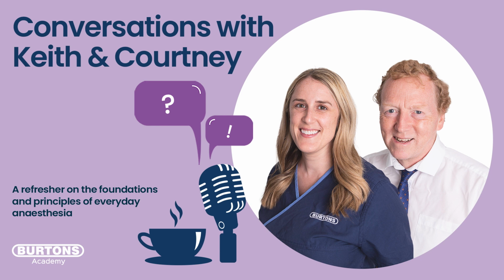What we've really done is reduce that minute volume intentionally to allow that CO2 to rise. You don't want it to go massively high, but you do want to let that CO2 build up, and you do want to allow spontaneous breathing to occur. And what will happen is, if you drop that respiratory rate from 20 to 15 or even down to sort of 10 or 12, the ventilator will give a breath, and then between that and the next ventilated breath, the patient will start to give a little breath on its own, and you start to see it breathing on its own. And then as that gets more and more intense, you can drop the respiratory rate or turn the ventilator off, and you'll then have a return to normal spontaneous breathing.